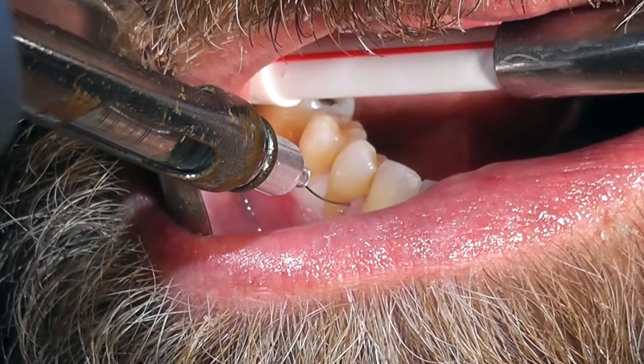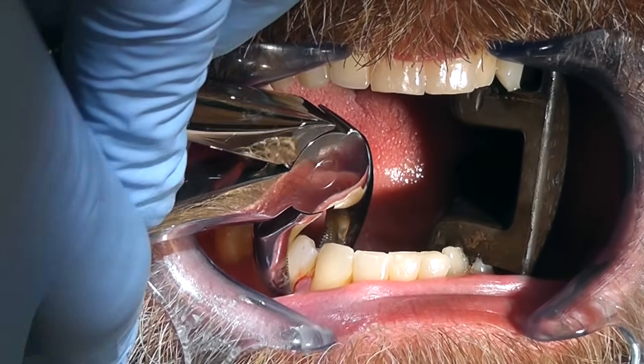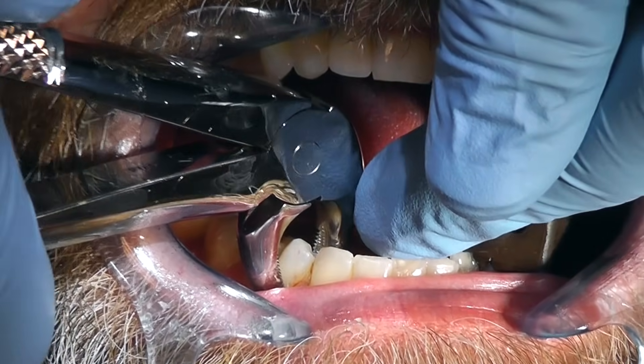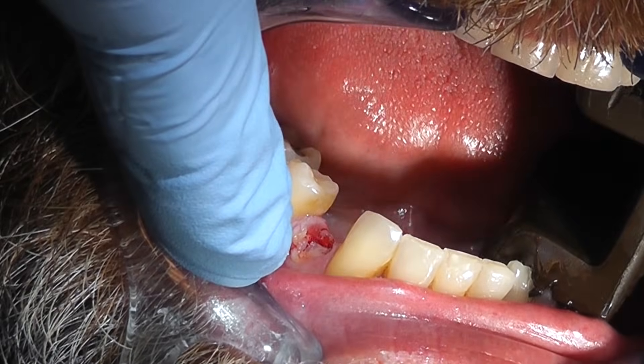Local anesthesia is applied, and in this case, because of internal resorption, we knew the coronal aspect of the tooth would be lost and the root would remain in the alveolar process. Once that happens, if necessary, you must flatten the tooth to slightly above the gum line with a bur.